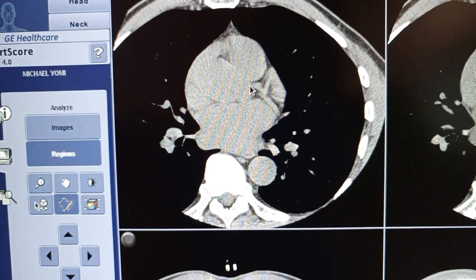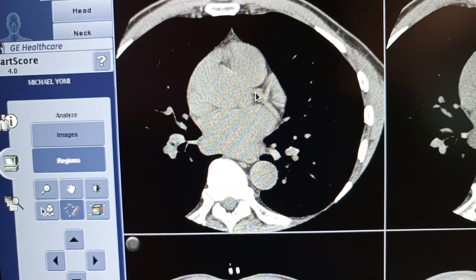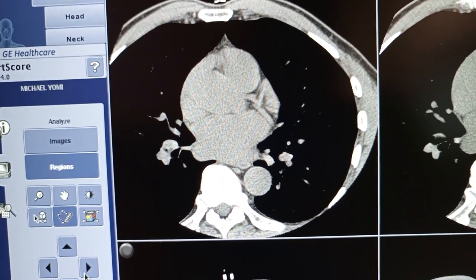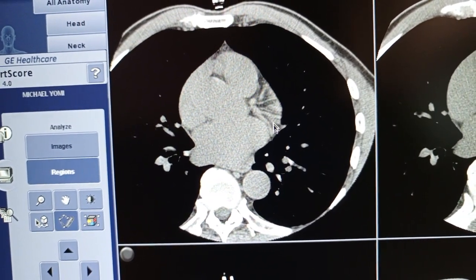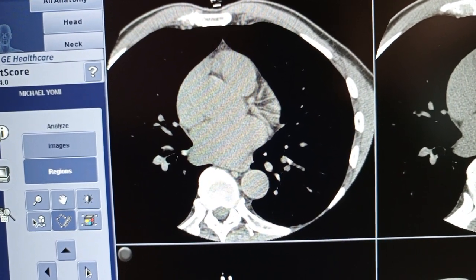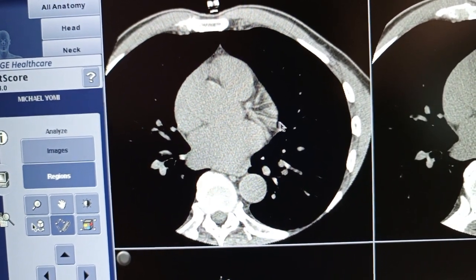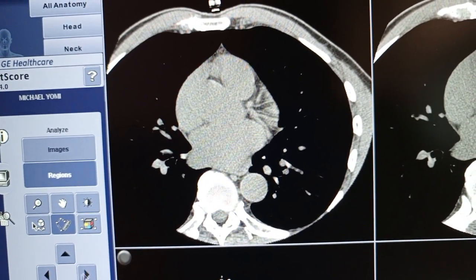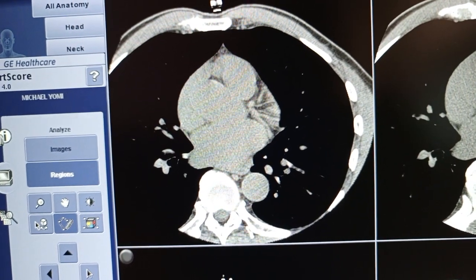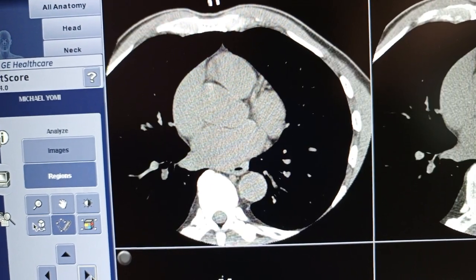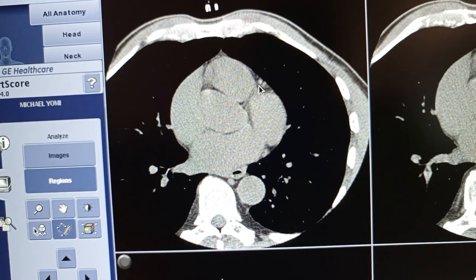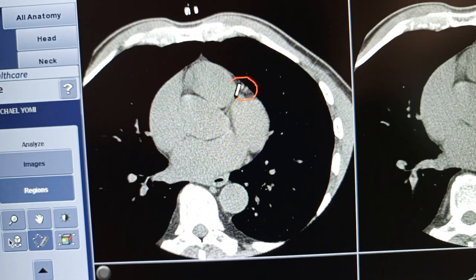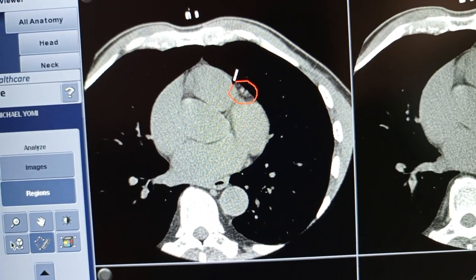Here you can see the left main coronary artery, the left circumflex artery going this way, its marginal branch, and the left anterior descending artery going that way. We are tracking the left anterior descending. If you see any kind of calcification within the artery, you mark it.